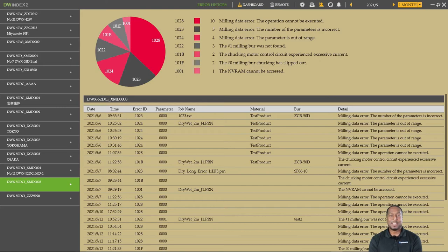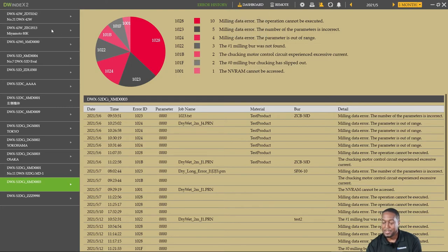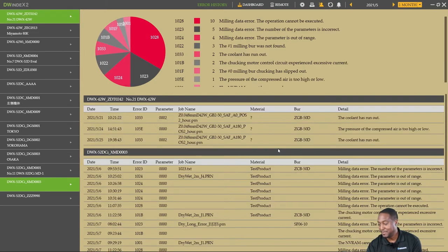The Error History Dashboard keeps a list of all errors that have occurred on each of your milling devices. To access the dashboard, hover over the Dashboard menu, then click on Error History. To the left of the screen, you'll see a list of all your connected devices. At the top of the main screen, you'll see the most frequent errors for all selected devices. The bottom of the list shows a running tally of each error, the time and date they occurred, and the type of error. You can also click on Other Machines to view errors from additional devices on the same screen.